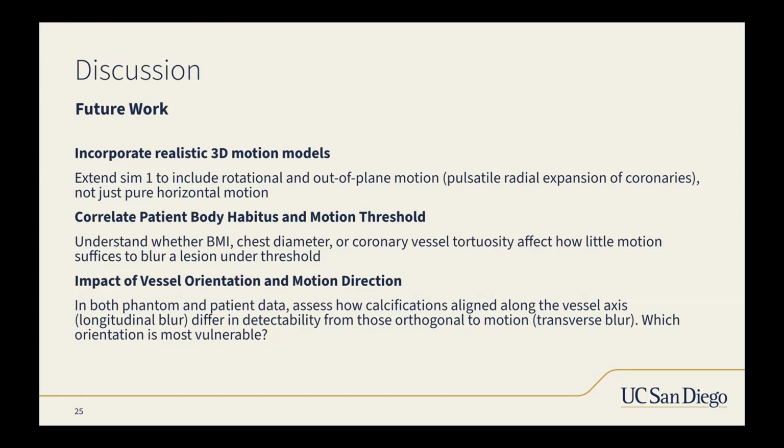And then also the impact of vessel orientation and motion direction. In both phantom and patient data, can you assess calcifications along the vessel axis, and do they differ in detectability when orthogonal to motion? So which orientation is most vulnerable, we were thinking about.